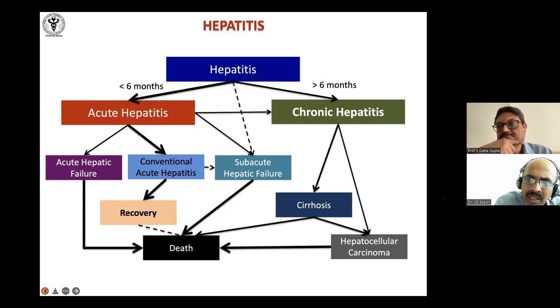Here's a question. Why not do only H&E and collagen? Why do PASD for all patients and not keep it only for storage disorders? Yeah, PASD helps. See, we do it for hepatitis. PASD also stains lipofuscin. The lipofuscin is normally found near the centrizonal area; it's a normal wear-and-tear pigment, in some of the hepatocytes.